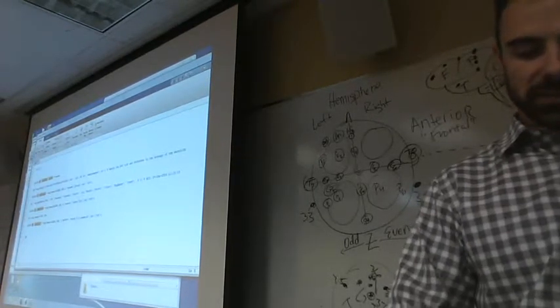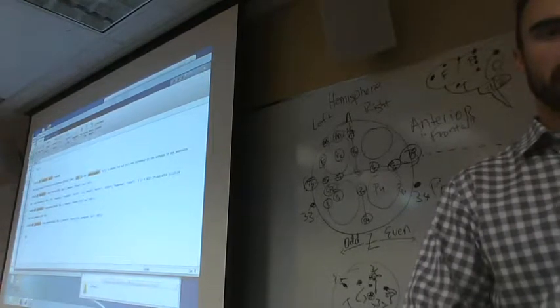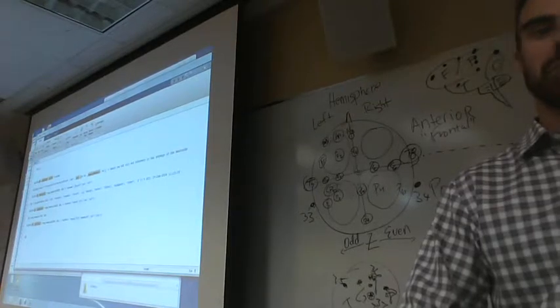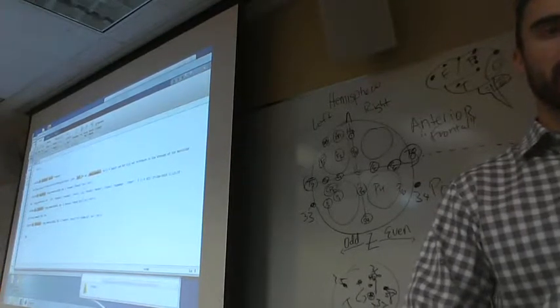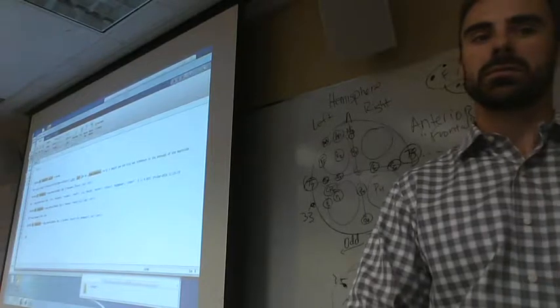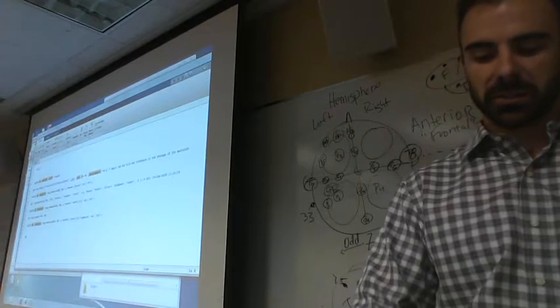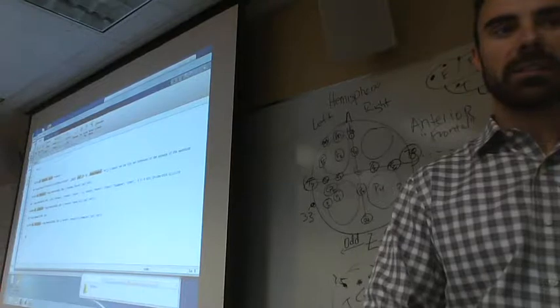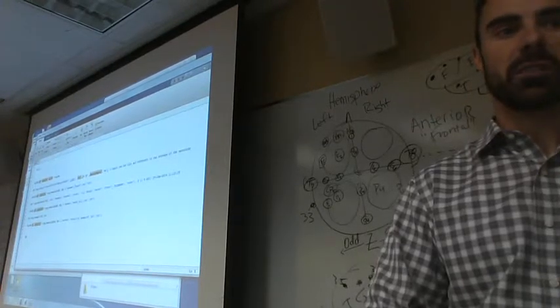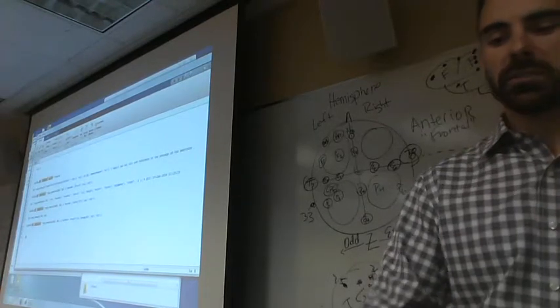Now we're going to press the apostrophe key. And that goofs everything up, but just do it with me. We're going to put another apostrophe key after this backslash. Now we're going to add a couple more things to our equation. At the end of BDF apostrophe, you can use the right bracket key. And at the beginning, before the apostrophe for our directory, for C, you're going to put the left bracket. See how everything looks happy again now?